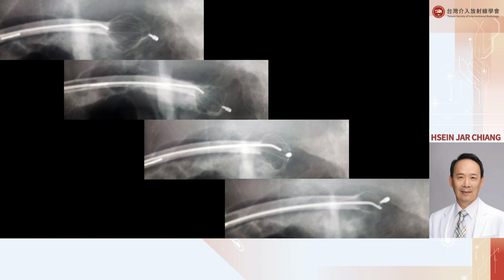So in these multiple steps, you catch the stone, just pull it back, then insert the stick and hit the stone. Gradually the stone will become smaller. Finally, it will be broken completely.